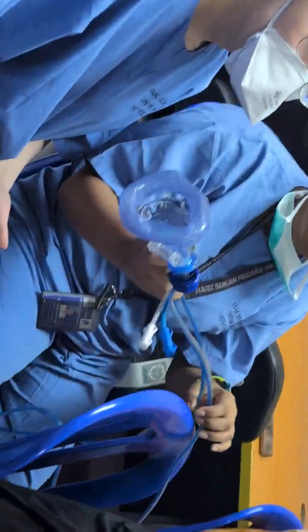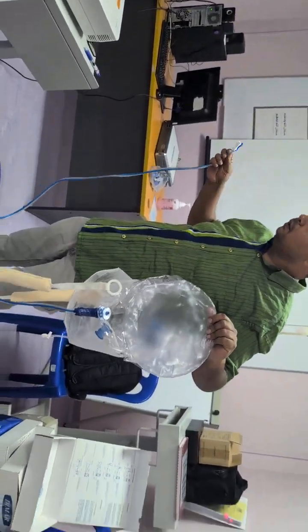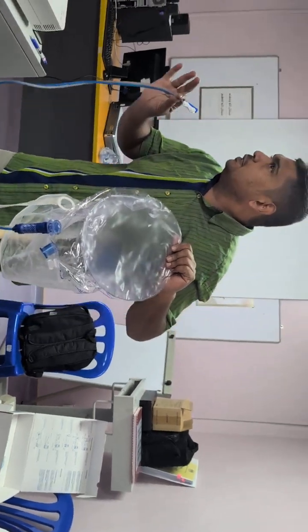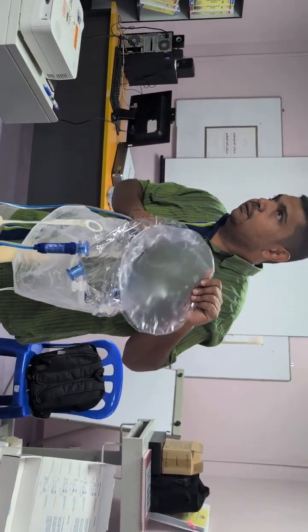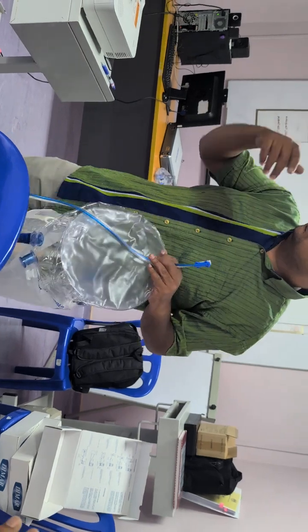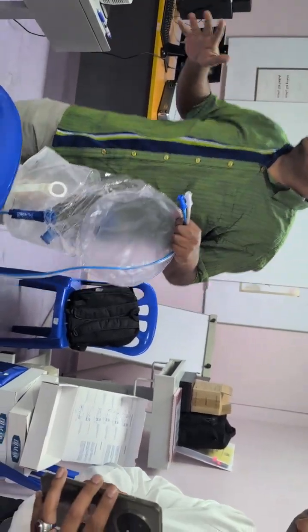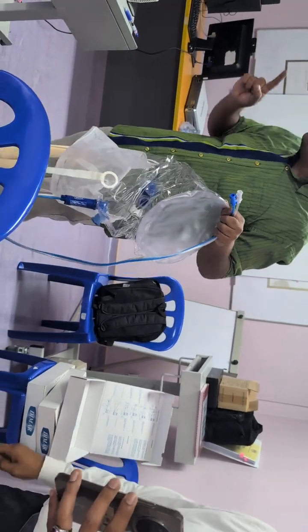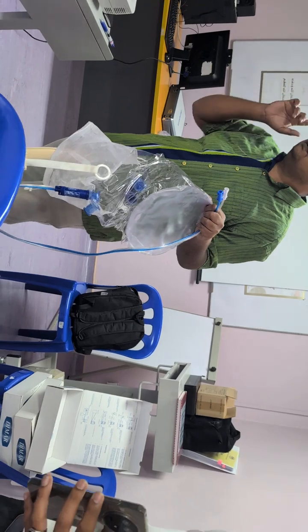Okay? Now, this one, I know for a fact that the ED fellas like it a lot. But is it suitable for ICU? This version may not be, because this is a CPAP version of it. But the BPAP version of it may be more suitable here. So, you see, doctors, with that, you want the patient to communicate back with you, memang tak boleh lah. With this, the patient can actually talk to you. The patient can pakai cermin mata, the patient can baca, the patient can do anything he or she wants to do.